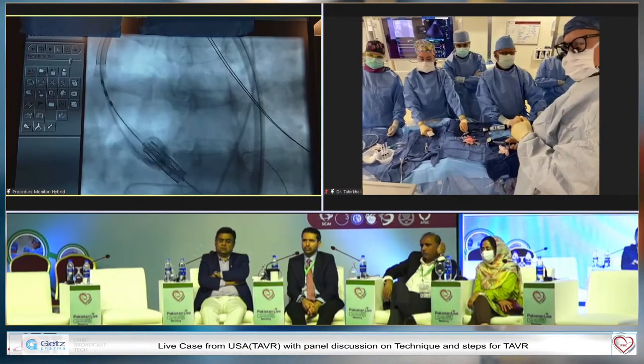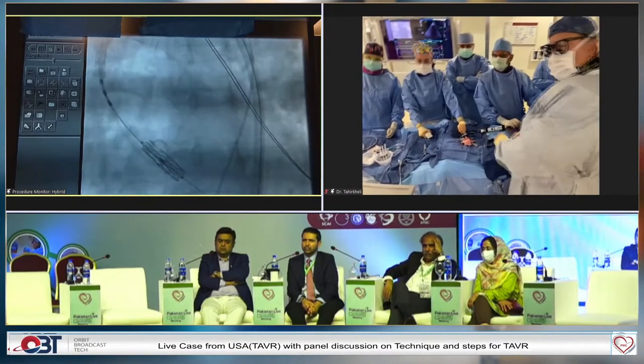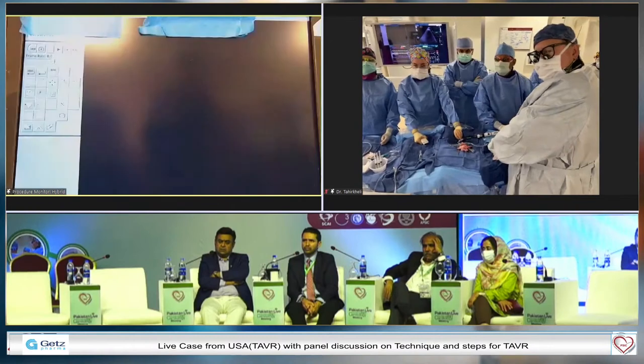Dr. Kwan, start pacing, please. You people use only these Sapien valves, no Evolut?